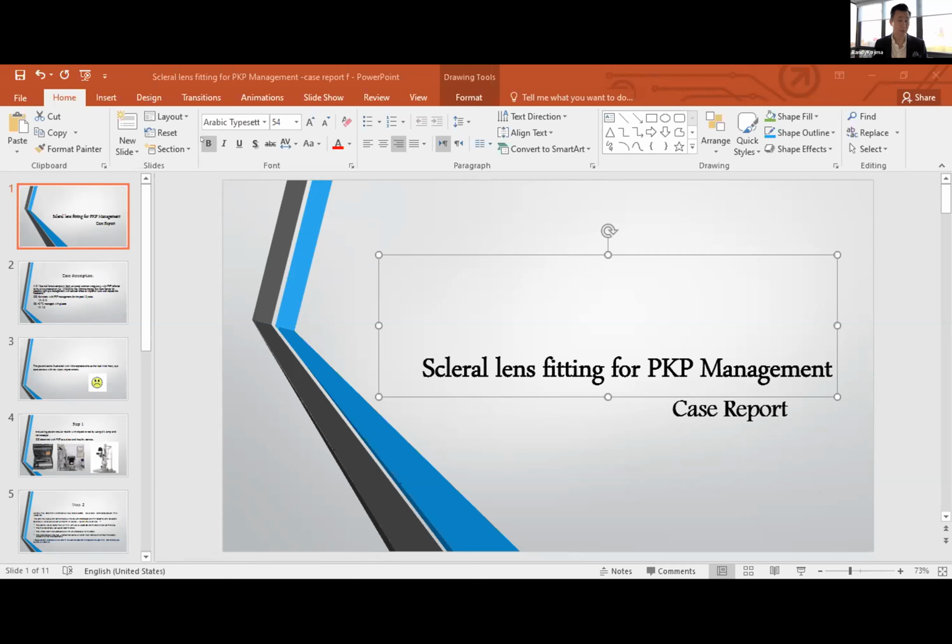So we have too much toricity. If the fluorescein comes in opposite to the markers, so let's assume the markers are here and here, and the fluorescein is coming in at 12 and 6 o'clock, that means that we have inadequate toricity. So those are some of the ways that we might try to determine if the lens fit can be adjusted to eliminate the fogging.